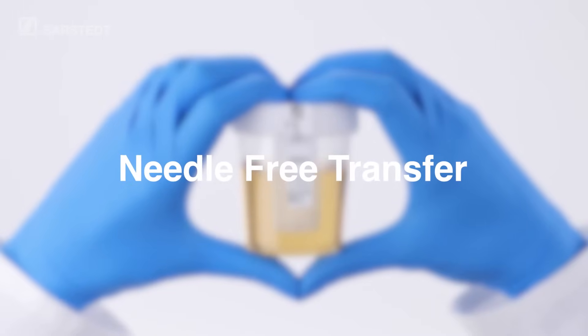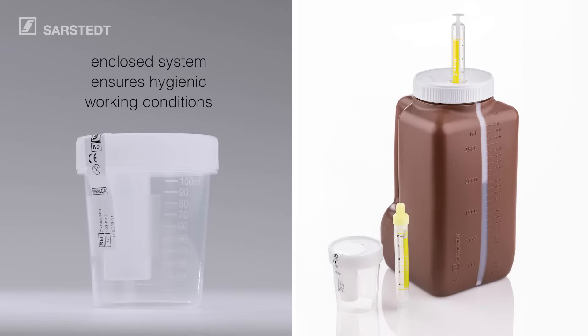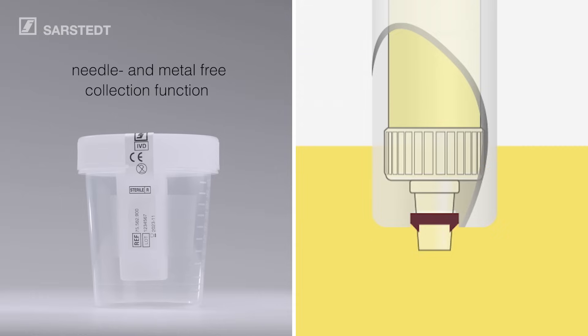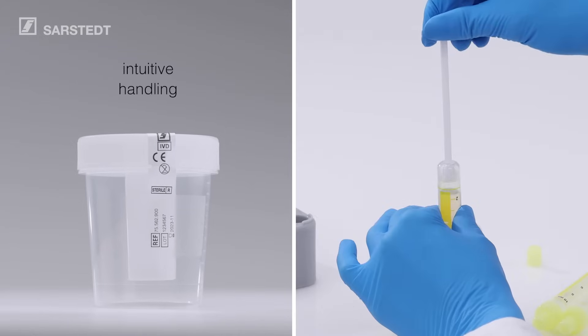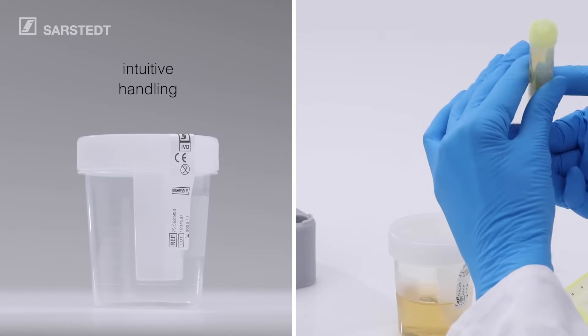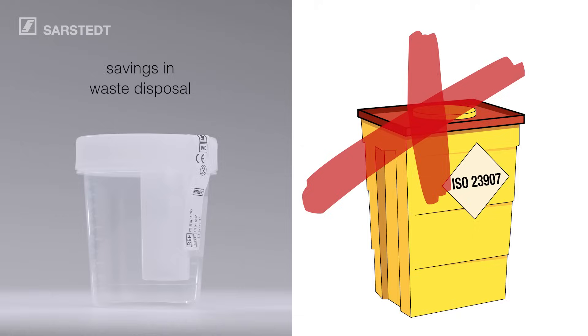NFT stands for needle-free transfer. Sarsted's NFT system combines the best of different product ideas. The enclosed system ensures hygienic working conditions are maintained throughout the entire specimen collection process, including storage and transport. The sophisticated needle and metal-free collection function minimizes the risk of injury to patients and staff. The intuitive handling with the practical Urine MonoVet can be learned quickly without extensive training. After use, NFT system products do not need to be disposed of separately in sharps containers. This saves time and money compared to devices with an integrated needle.